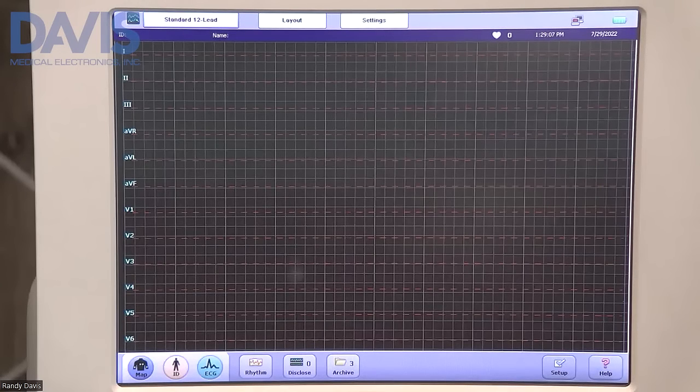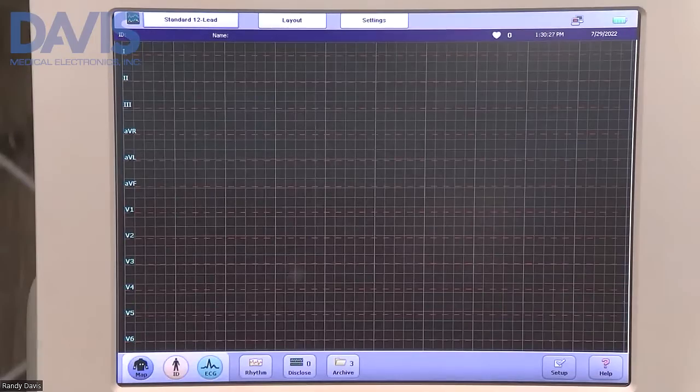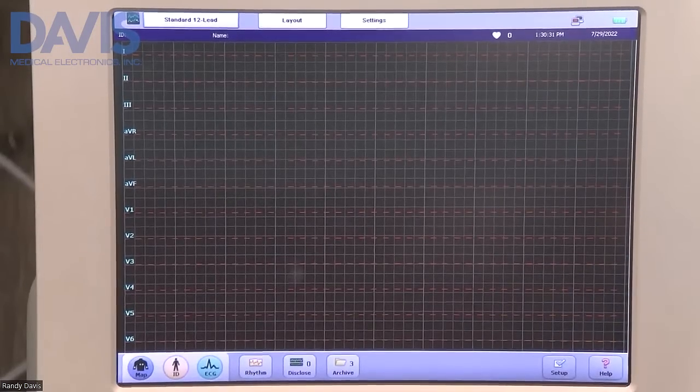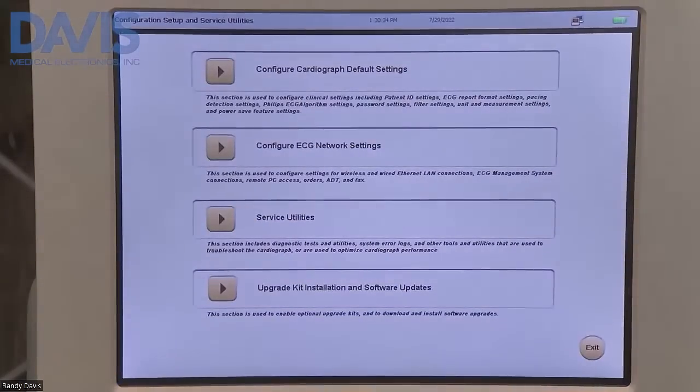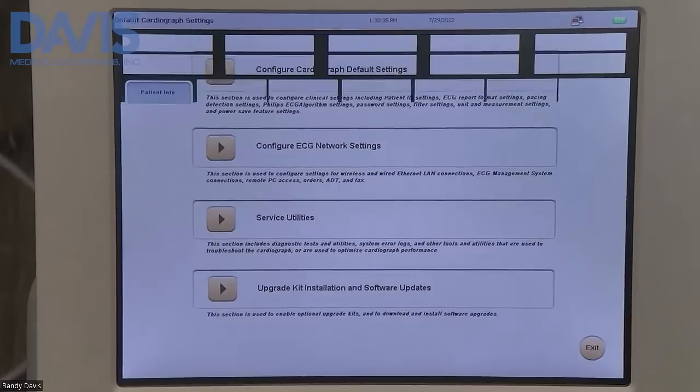This is a video on how to configure your cardiograph to do an extended ECG. You're going to click on setup, configure cardiograph default settings.